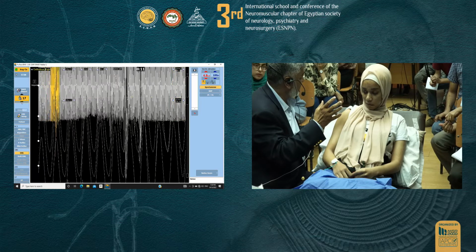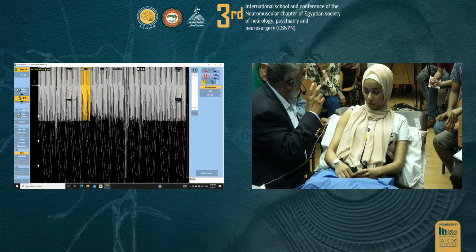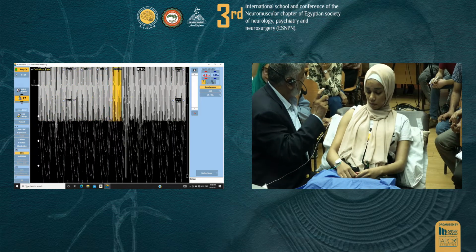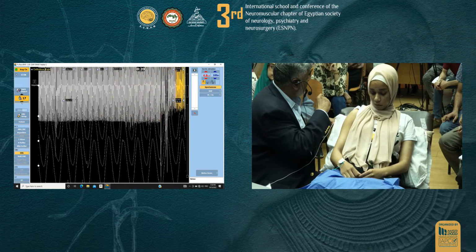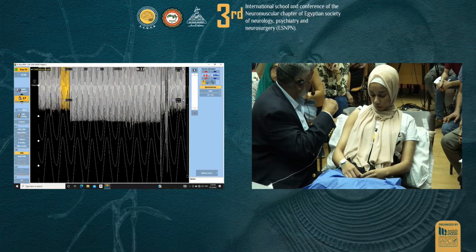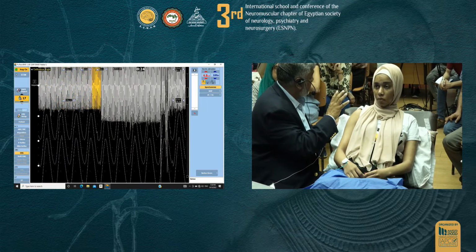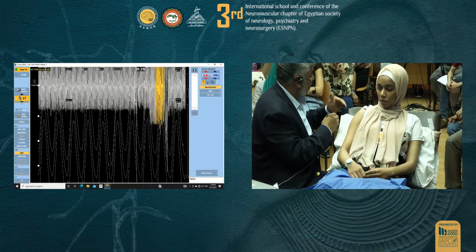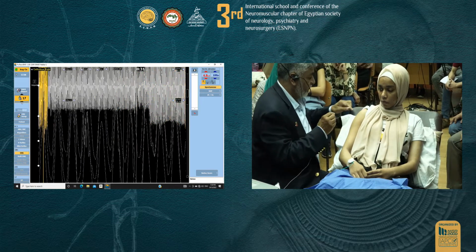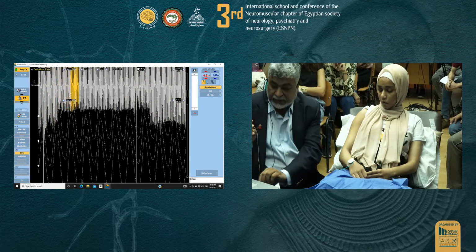Don't have to see them, okay? The firing pattern of each potential, I'll go over that. You can tell where the potential is coming from. Is it coming from the motor unit, axon, or from the end plate? They're totally from muscle fiber. So the original motor unit tells you the firing characteristic and amplitude, all that we'll go over in the examples. Let's go there right now.